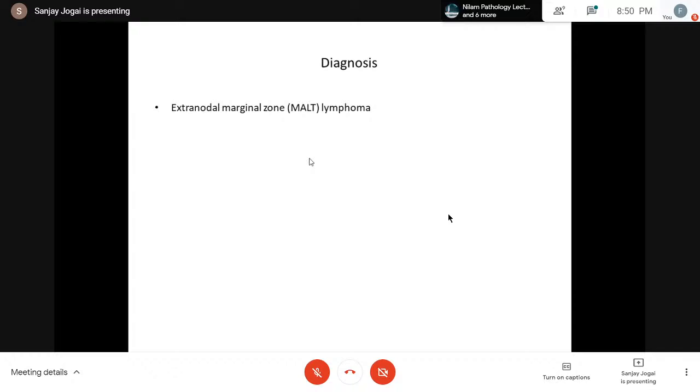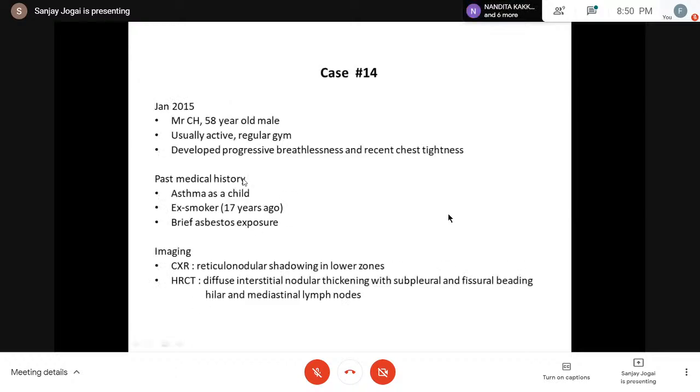Now when it comes to pulmonary lymphomas, most of the time, common things being common, in core biopsies we see lots of diffuse large B-cell lymphomas. In excision specimens, we tend to see marginal zone lymphomas. Less commonly, you will see, which I showed you previously, LYG. But Hodgkin in the lung as such is very uncommon. Within the mediastinum, we see a lot. I'll do the mediastinal entities in another session, so I'll restrict it now. And that's the final case.